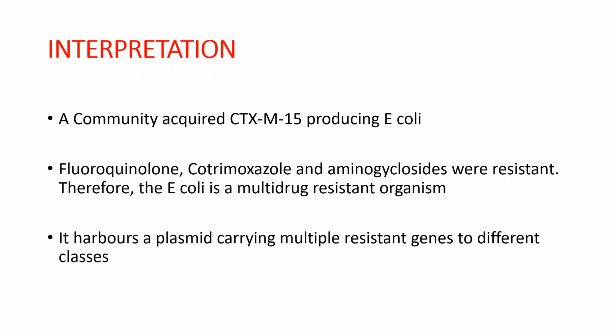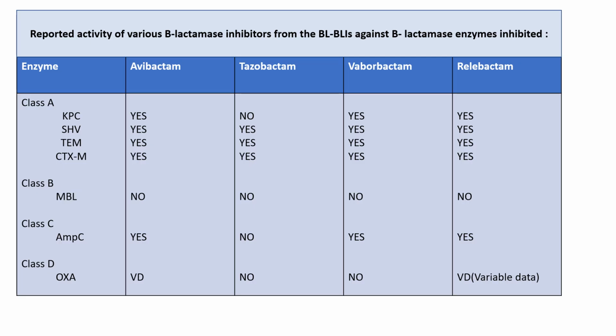So this case was a community acquired CTX-M-15 producing E. coli, where different groups of antibiotics were resistant. Hence, it is a multi-drug resistant organism, and it is possible that it carries multiple resistance genes to different classes of antibiotics. Particular infection control precautions need to be followed.